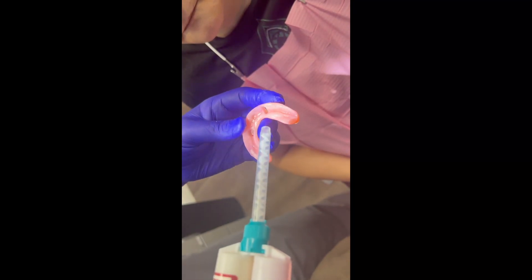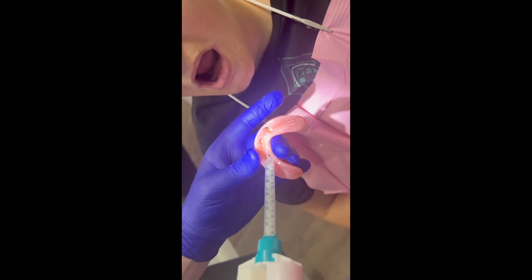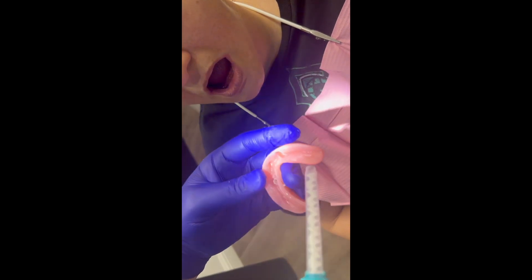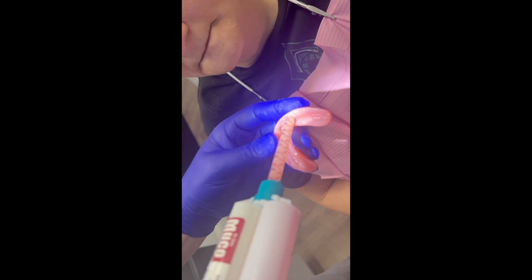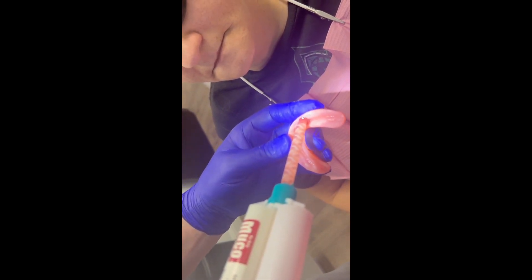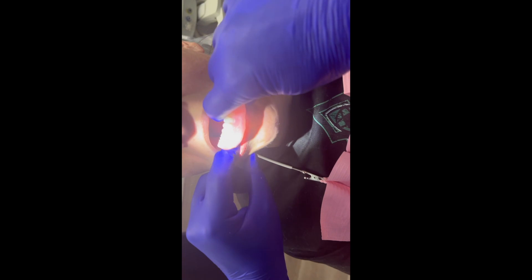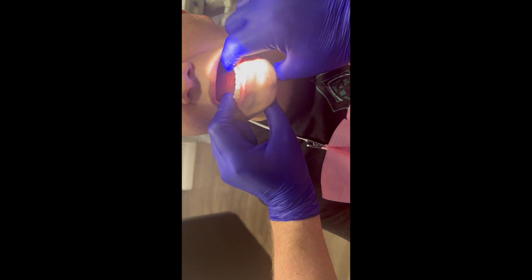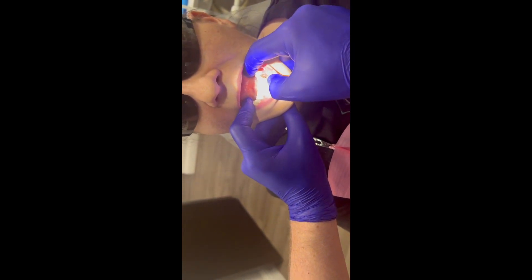The same process on the other side. I'm not going to need a custom block-out here because we already have the locator in place, so I'm doing the custom block-out on this side and then loading the hard reline material. We have that big vent which is nice. The patient now knows the procedure — if it gets hot, raise your hand and we pull.